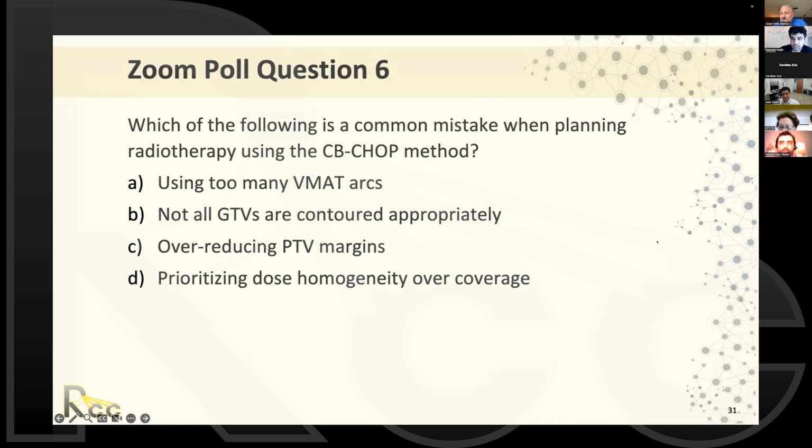Yeah. I think it's what your team is most comfortable and happy with. Here in our practice, as you say, we put it in the treatment planning system and do it afterwards, and everyone seems to be happy with that approach, but we always have the option of including it in the simulation if we feel that will help. So maybe you can try both approaches at your center and see which one works better for you. Yeah.